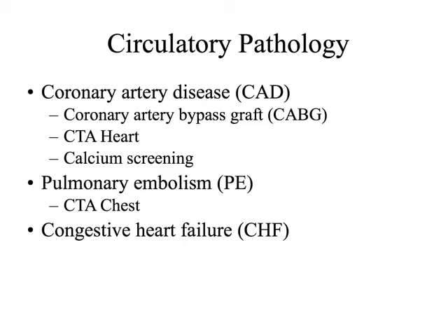And then, of course, congestive heart failure. We don't really have a CT exam geared towards that, but it's very easy to evaluate for CHF on CT images. So we won't actually address that in a particular protocol. Just routine chest CT would be able to evaluate that.